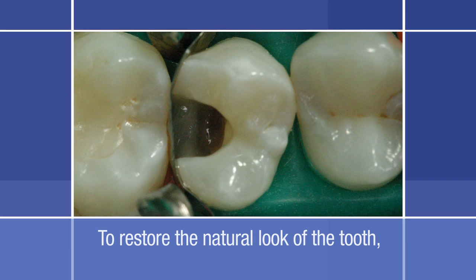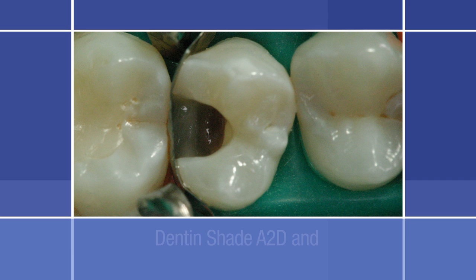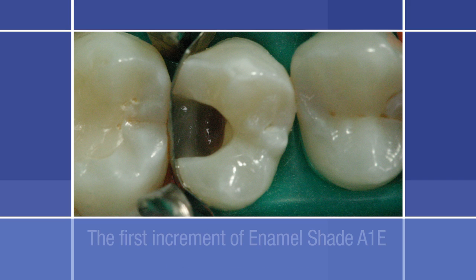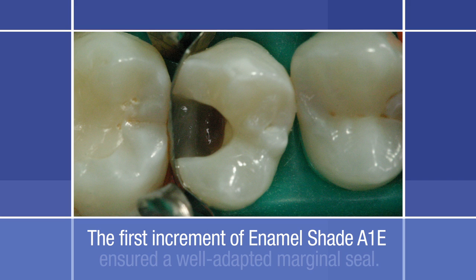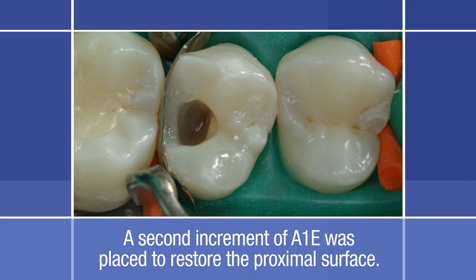In order to restore the natural look of the tooth, two shades and opacities were used: dentin shade A2D and enamel shade A1E. A first increment of enamel shade A1E was carefully placed in the proximal box at the cervical cavo surface margin to ensure a well-adapted marginal seal. A second increment of enamel A1E was placed in order to restore the entire proximal surface. To flatten the composite against the matrix band, a micro brush was used, similar to the one used for the application of the adhesive.